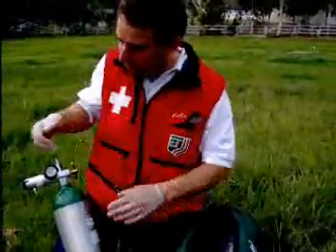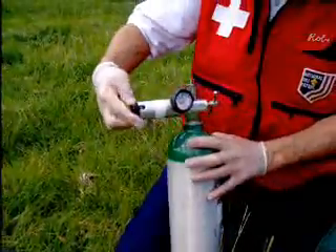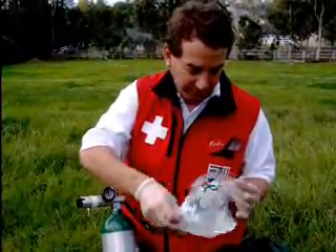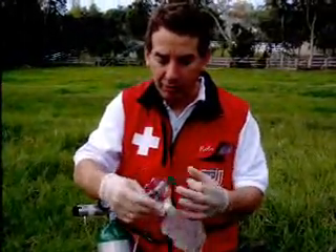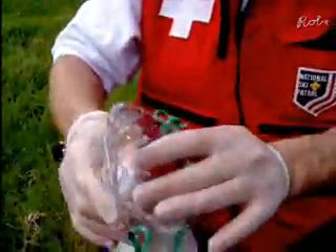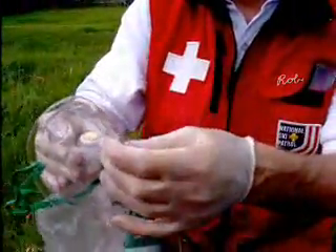This cylinder is ready to go. If I turn the flow up now, you can hear oxygen coming out. So now we need a device to administer it to the patient. For most situations, we use something called a non-rebreather mask. The way the non-rebreather mask works is oxygen comes into this bag and fills a reservoir, and then goes up into the face mask area.